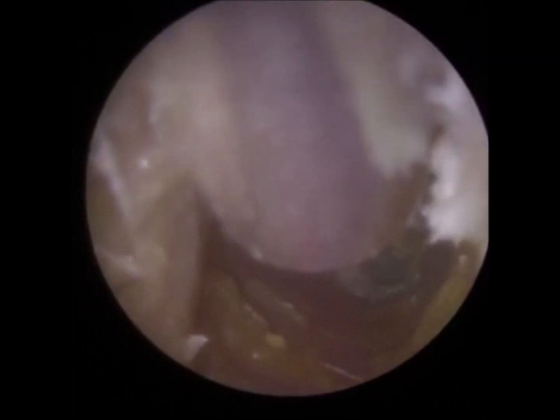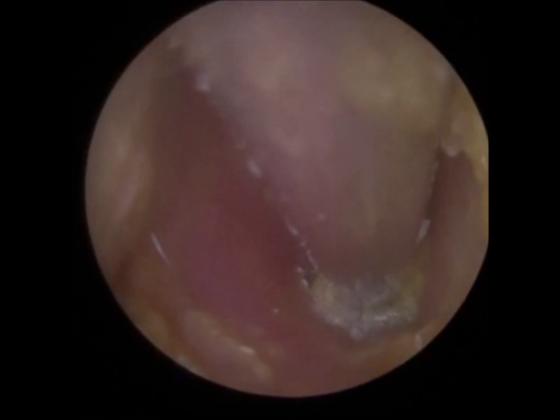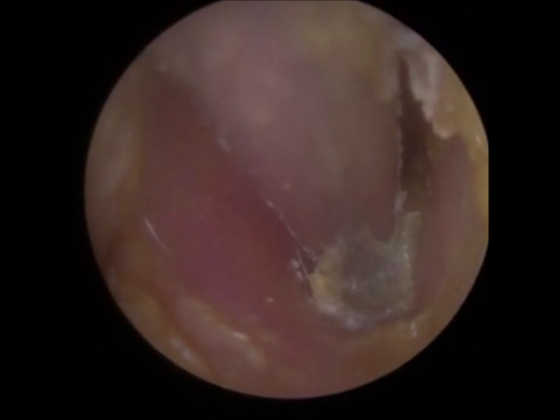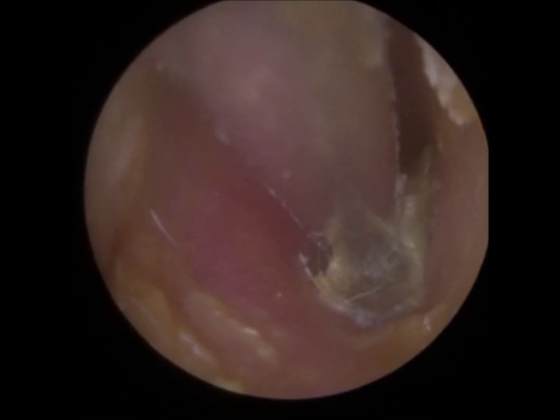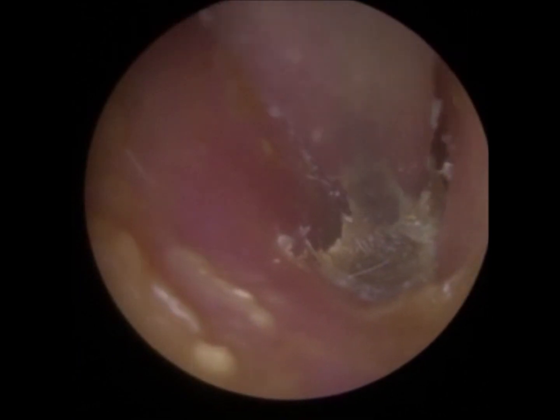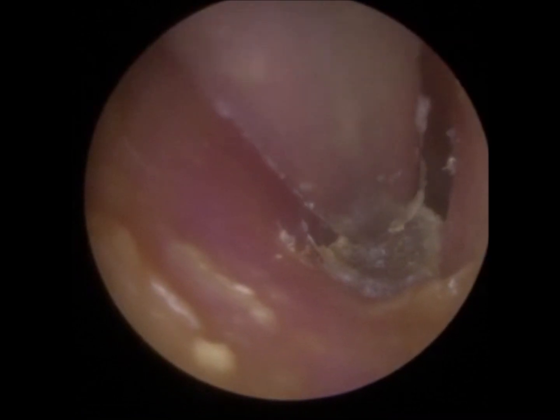I've got an instrument to put all the way up — it's scrolling in. There you go. You really need to cut it out here. You can see that it shows how much the wax is compacted and how it's been building up.